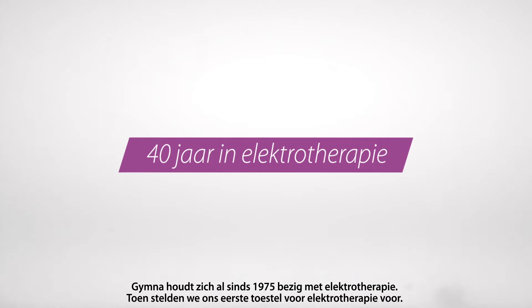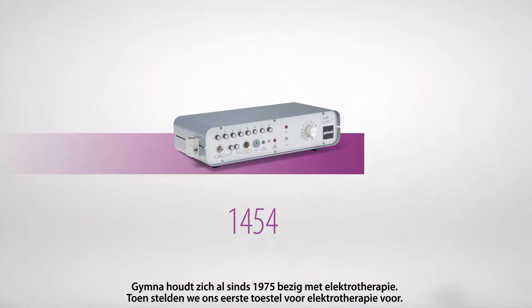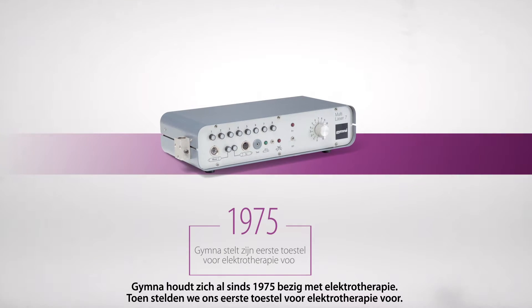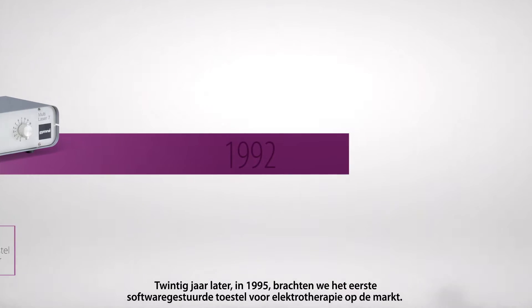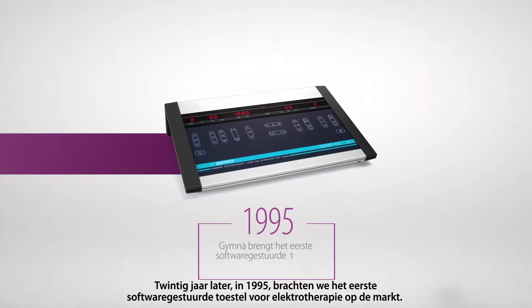GYMNA has been in the business of electrotherapy since 1975, when we unveiled our first electrotherapy device. Twenty years later, in 1995, we released the first software-driven electrotherapy device.